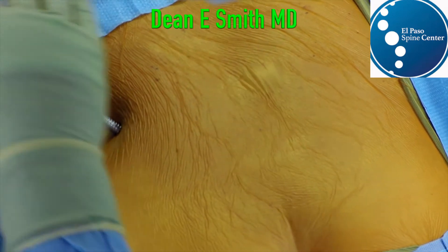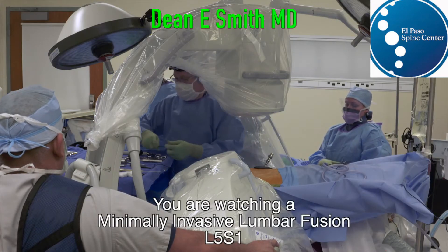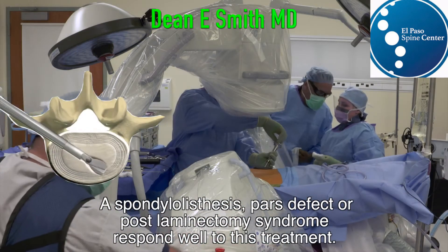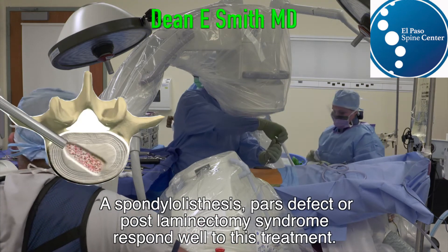It is through this working cannula that we're going to place the various tools and devices that we use to remove the disc. And we can appropriately prepare the end plate.